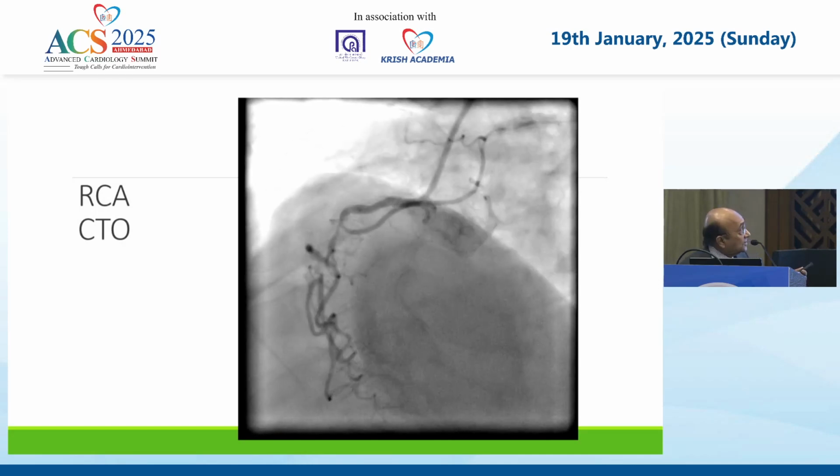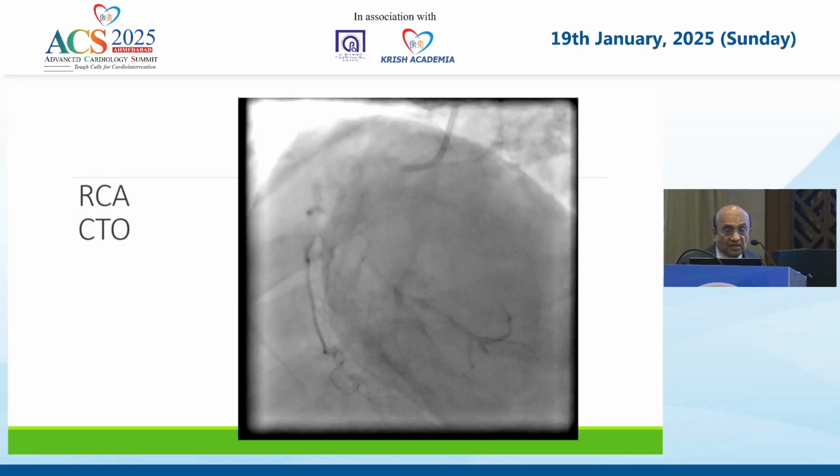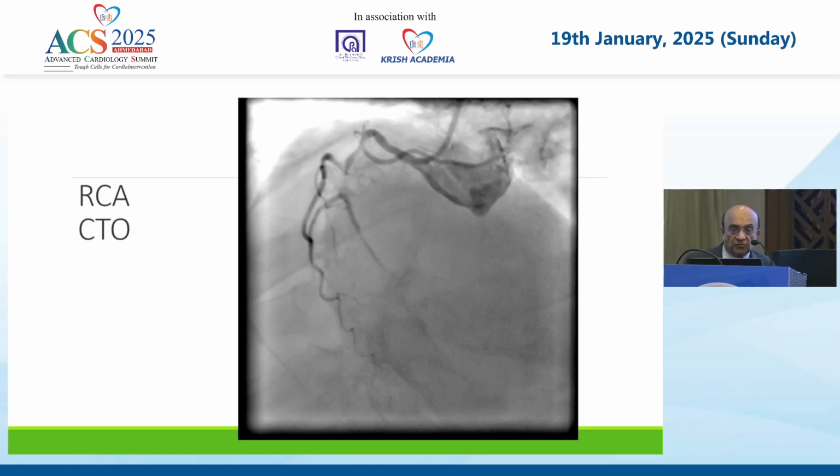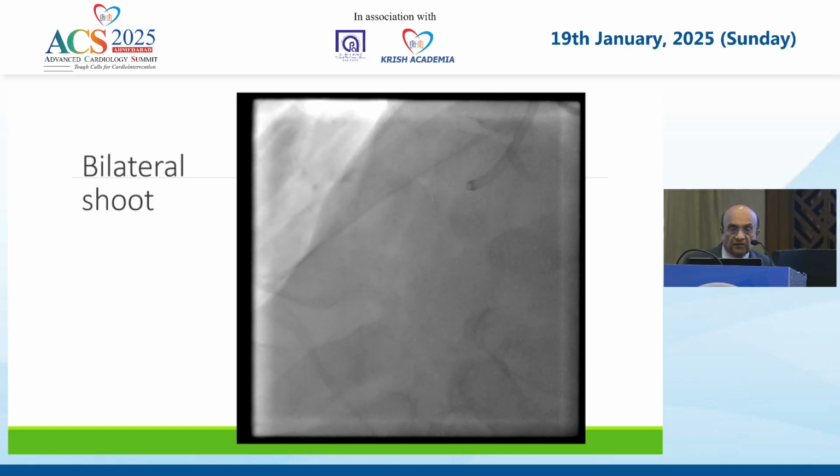But now this is an RCA CTO. Sometimes it looks very simple. This is a short CTO, and you think it's going to be a cakewalk and will be done in no time.